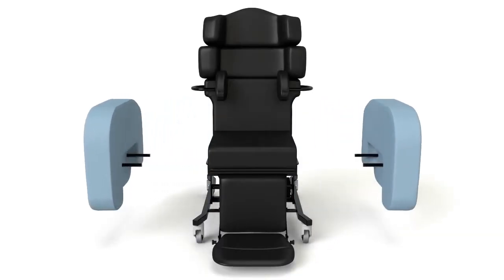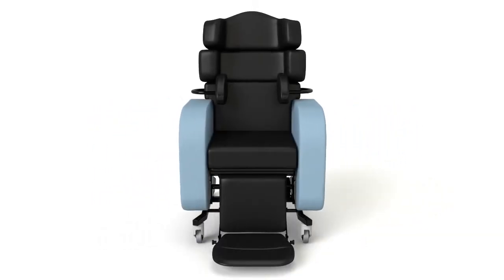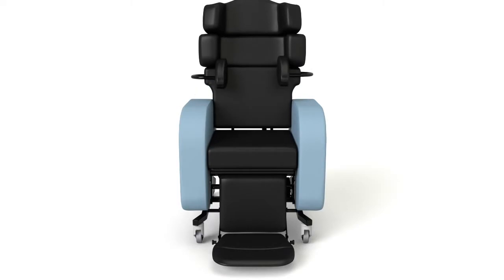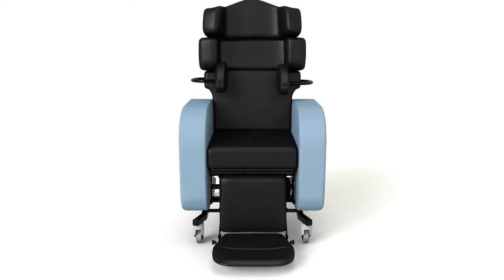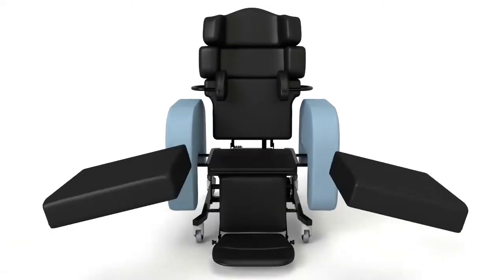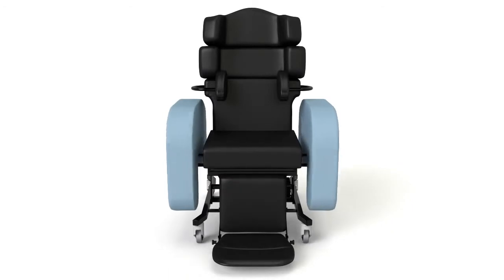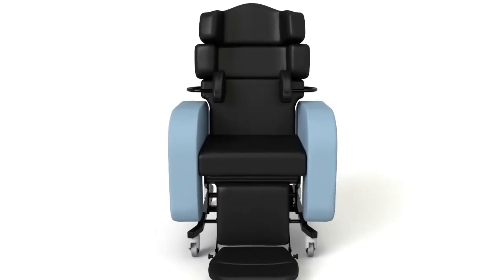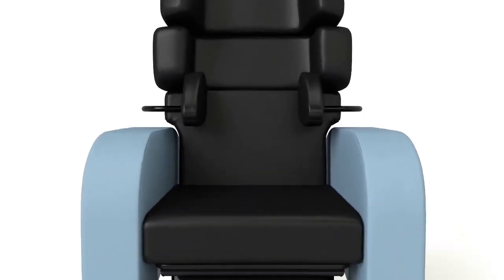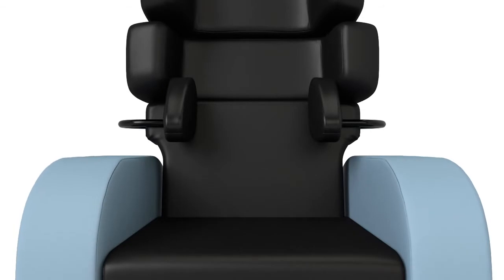The arms are removable to assist with sideways transfer or for the application of slings. Adjustable arm widths accommodate a variety of cushions for individual sizes and pressure management needs.